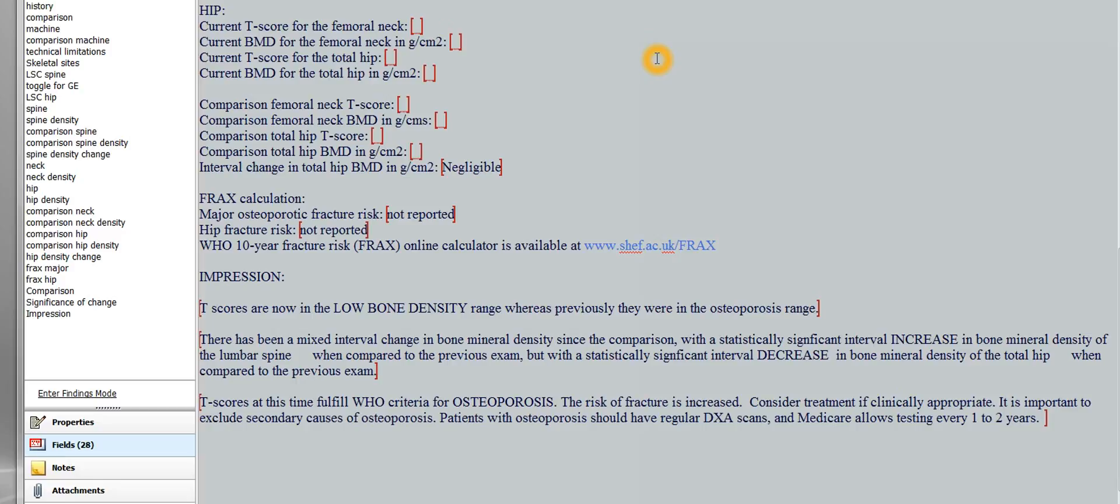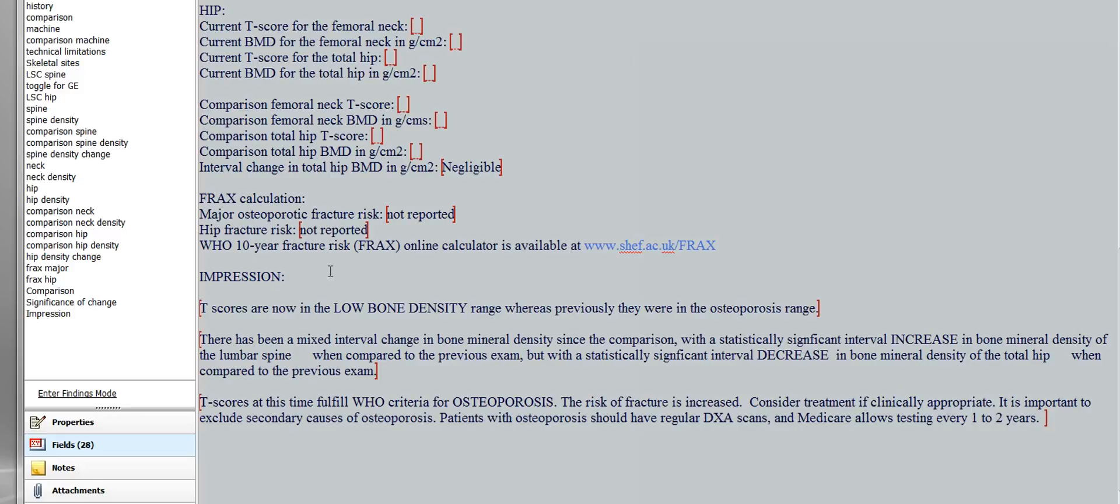All right, so this is the video part two. It's actually part two of my third video. I was talking about how to fill in the PowerScribe reporting template for radiologists who are reporting the DEXA scan results, and this is the comparison template, the one that has a comparison. So I had covered everything on the previous video down to impression, and now I wanted to talk about the impression.